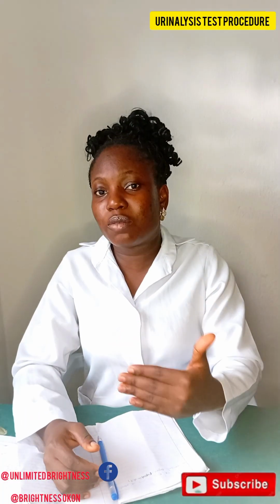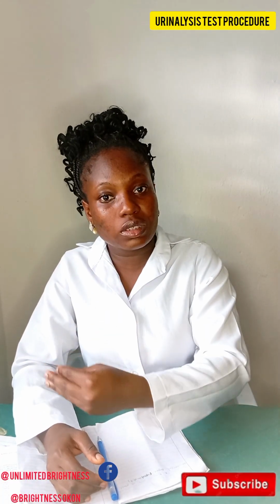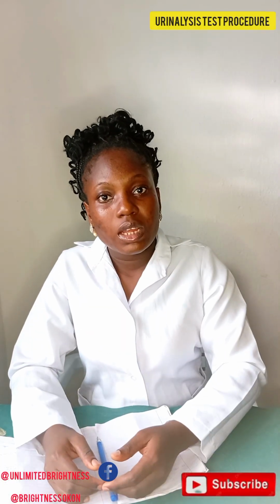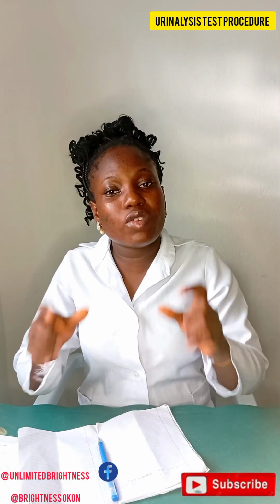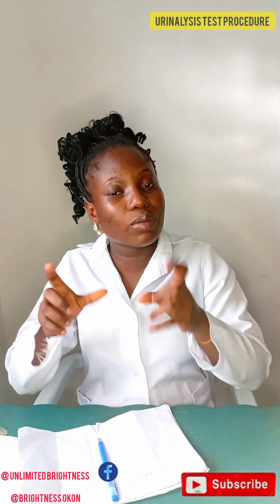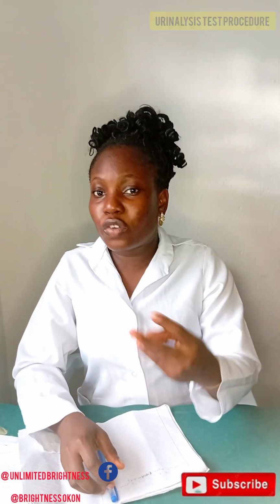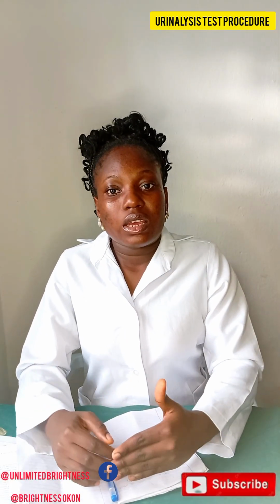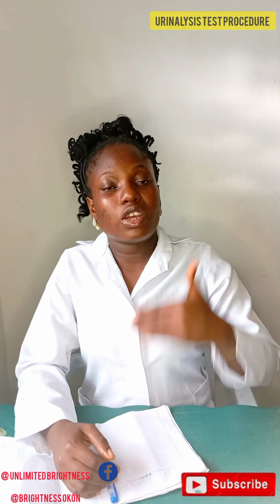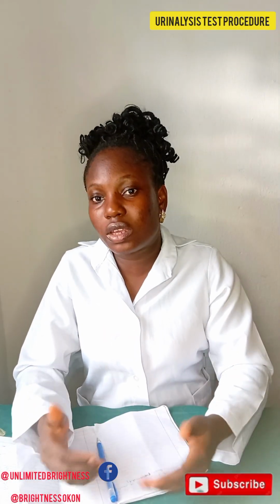When your red blood cells break down, the final byproduct is bilirubin. When there is excessive bilirubin in your urine, it is raising an alarm that too many red blood cells are breaking down, which is also a call for concern. So this test is not just a test like people may think. It is a screening test, and it helps your physician know the level at which your organs are working.